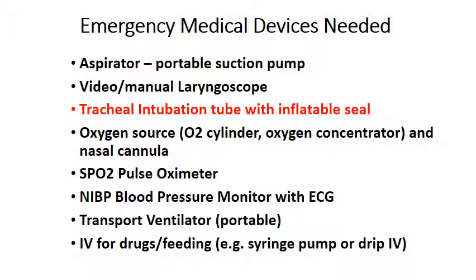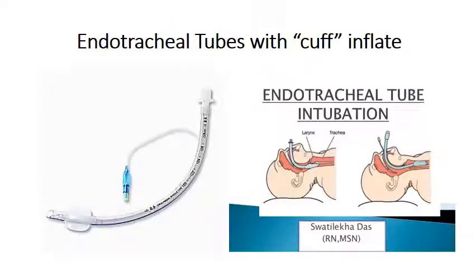The tracheal intubation tube is not a serviceable item, but it's something that a biomedical technician and engineer needs to understand the function of to appreciate ventilation. Technicians have to understand the function of endotracheal tubes, even if there's no service involved. These are used for intubation in a patient that is not able to breathe, inhale, or exhale on their own, and they involve insertion with the aid of a laryngoscope, and then inflation of a balloon which will seal off the passage and ensure that the air can be forced into the lungs without leakage.